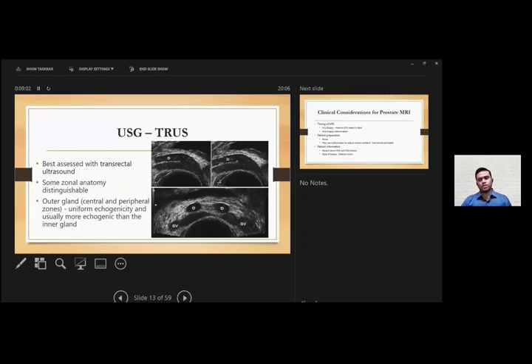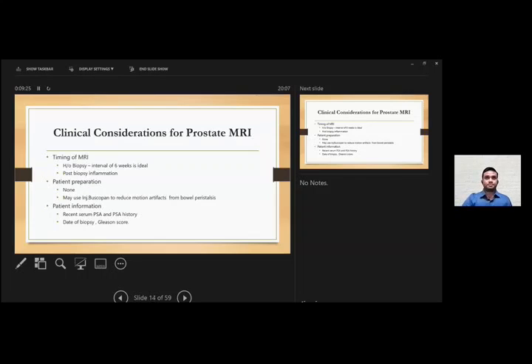There has been some use of prostate elastogram, but it has not taken up in routine practice. Transrectal ultrasound for prostate is usually done for primary or secondary infertility in males to visualize the ductus deferens and seminal vesicles to see if there are any obstructive lesions.